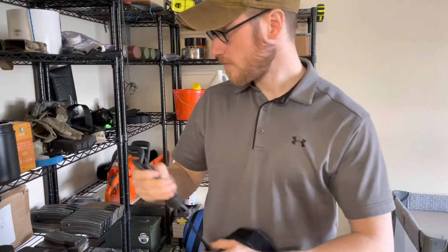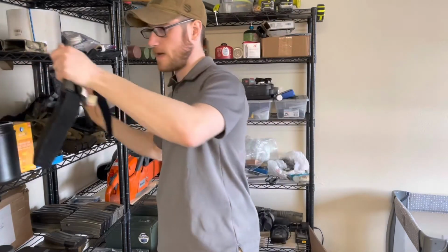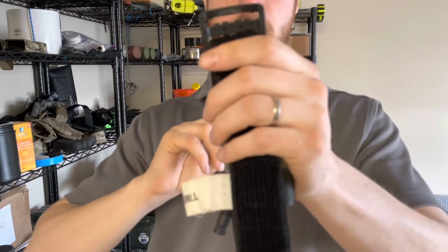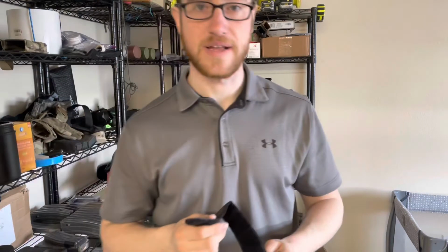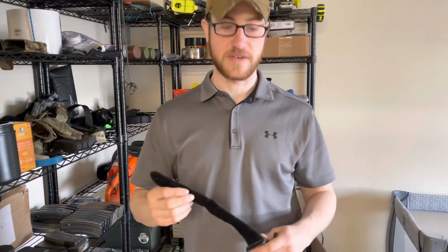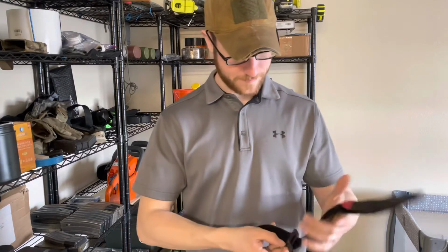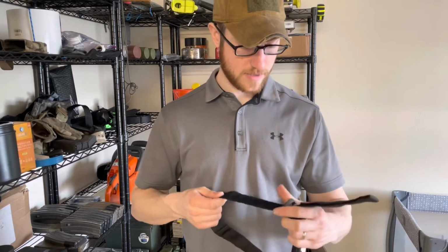So for training purposes, if you're using earlier generation CAT tourniquets for training, I just run through the deeper of the two friction adapters and then call it good so that it more closely simulates the Generation 7 tourniquet. We're going to stow that up the same way, and then we're going to go into some demonstrations.